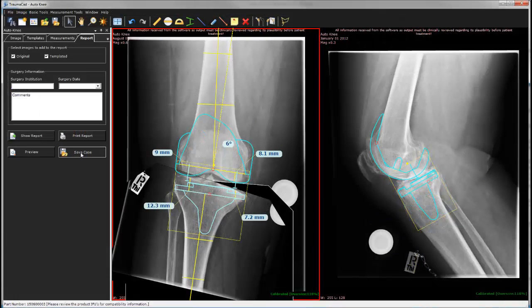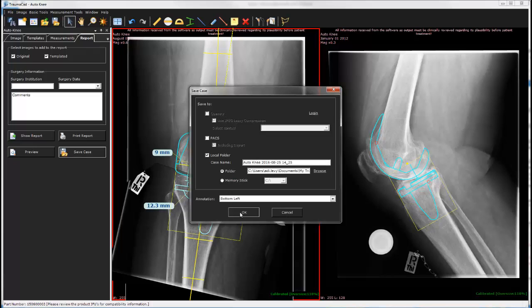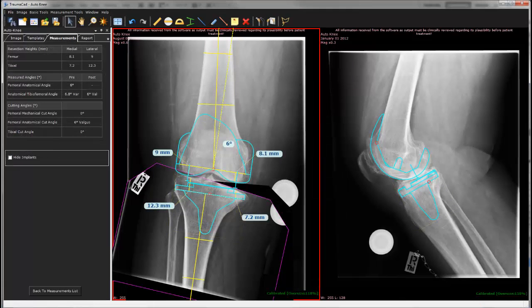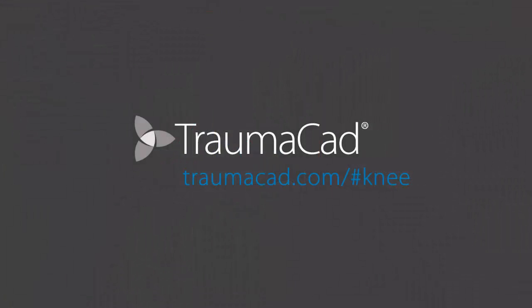Save the case to any desired location. You can always go back to a saved case to continue planning from where you stopped. Tramacad keeps setting the standard in orthopedic digital templating, and we invite you to experience its great benefits.